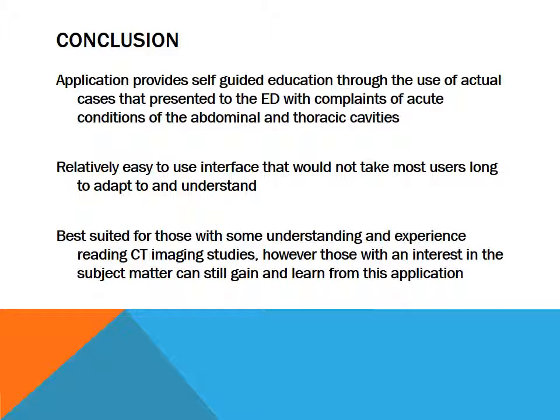To conclude, this application provides a self-guided education through the use of actual cases that presented to an ED with complaints of abdominal and thoracic issues. The application is relatively simple and easy to use and should not take most users long to adapt to and understand it so they can utilize it to its fullest capabilities. It is best suited for those with some knowledge of CT imaging studies. However, any provider with an interest in the subject matter can still gain from using this application.